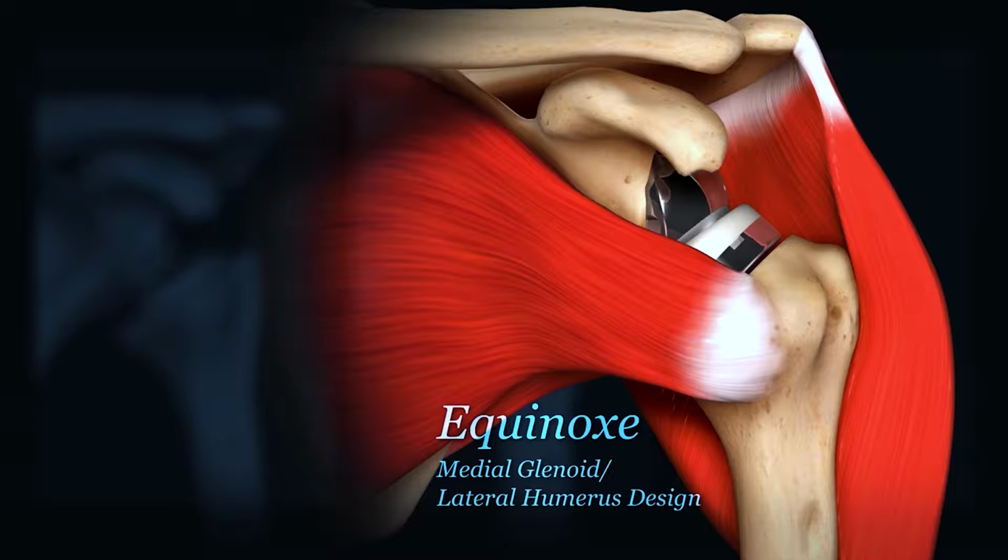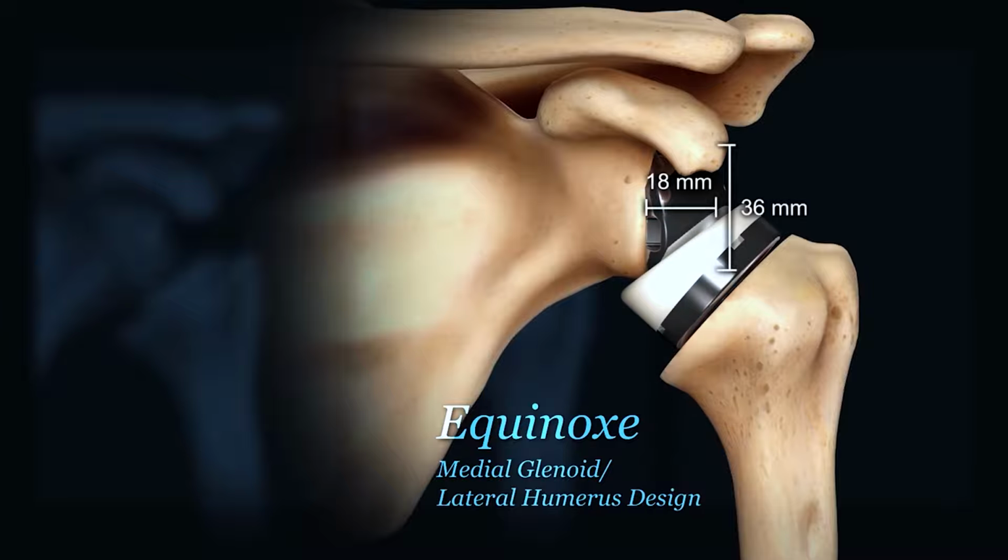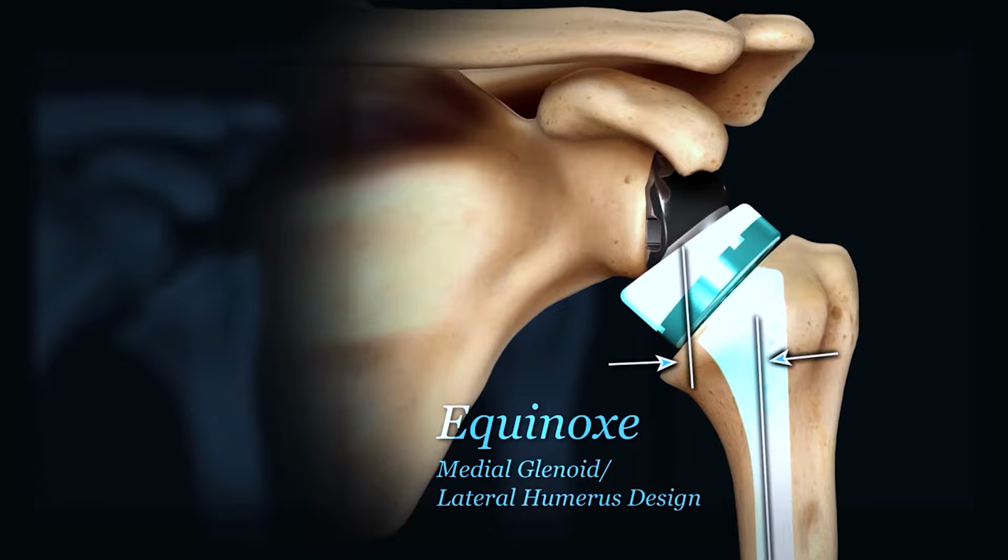The humerus can be lateralized to also minimize scapular notching by decreasing the Grammont humeral neck angle of 155 degrees, proportionally increasing the Grammont glenosphere diameter and thickness of 36 by 18 millimeters, decreasing the humeral liner constraint, and by increasing the medial offset of the humeral prosthesis.